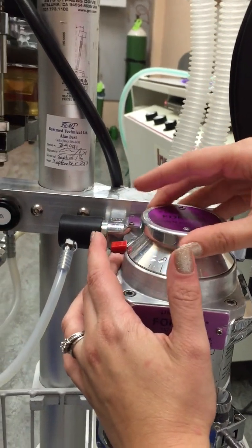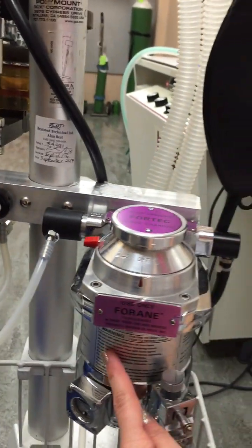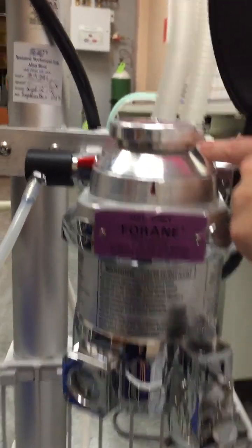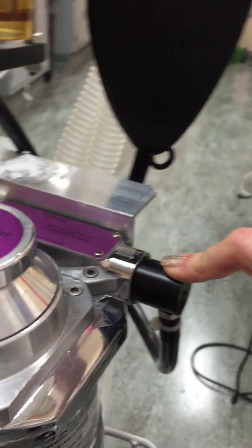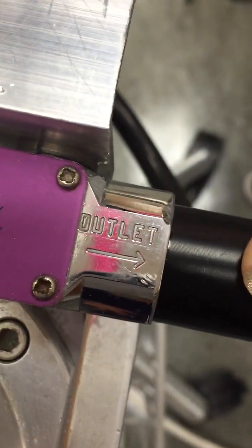Okay, there's a little lock there to keep that safe. From there, it will come out the vaporizer to this vaporizer outlet. So if you look here, there is a sign that says outlet.